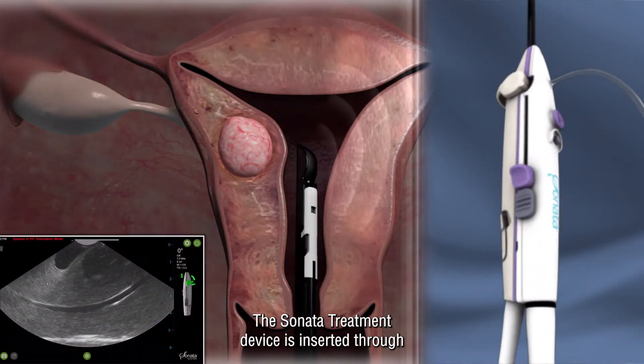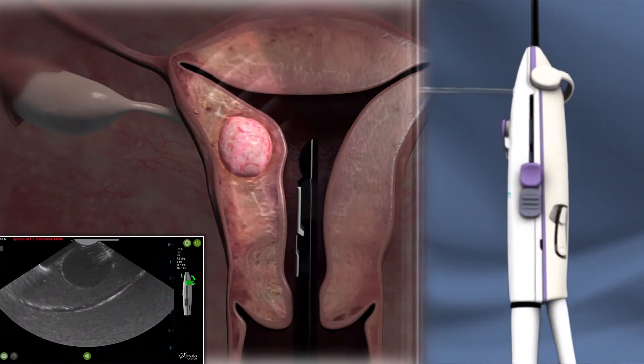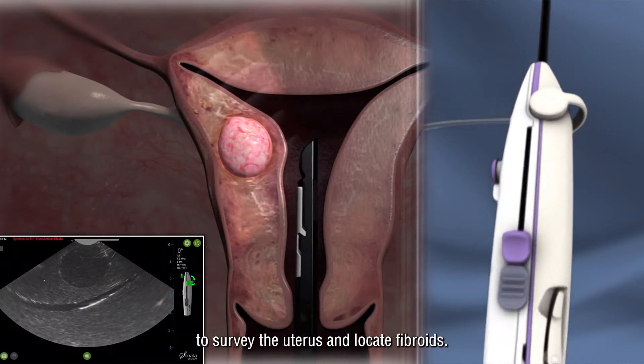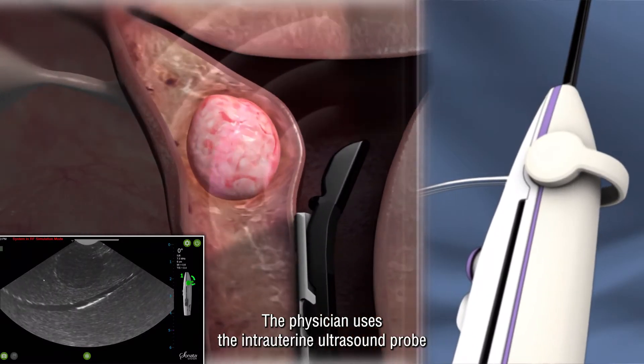The Sonata treatment device is inserted through the vagina and cervix and into the uterus. The intrauterine ultrasound probe allows the physician to survey the uterus and locate fibroids.